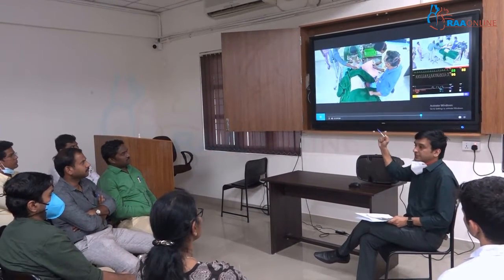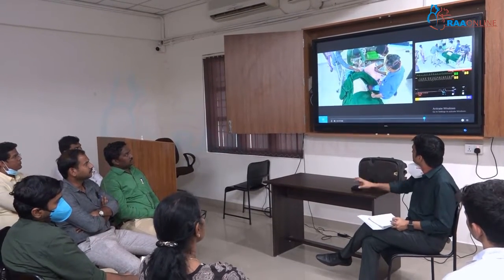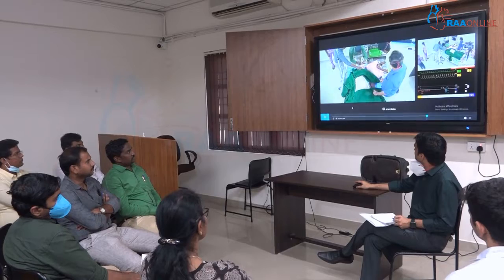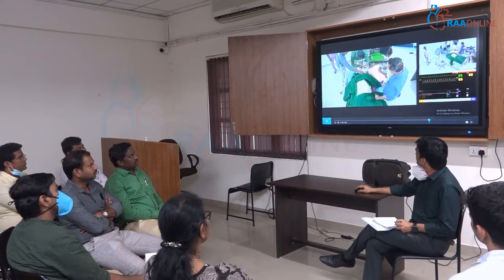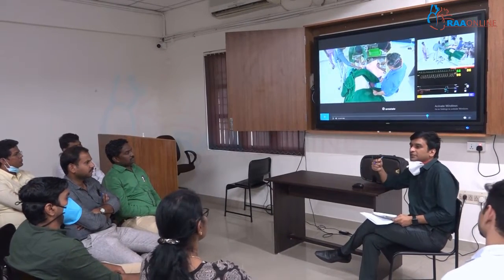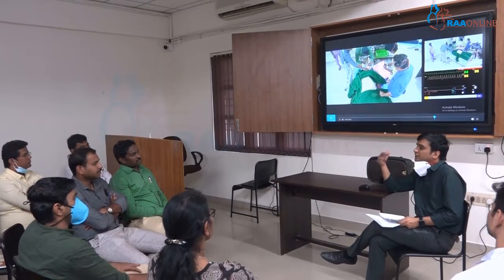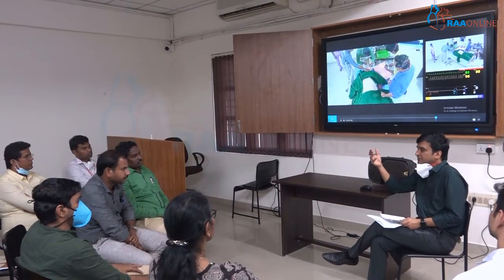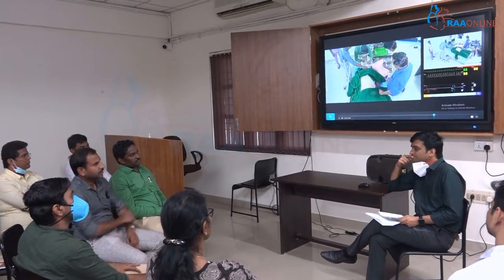So this is the first step. Saturation is fine. So give me just 5 more minutes. I've always wondered how long should I try an intubation before I go back to mask ventilation. What are your thoughts on it? When should I go back to mask ventilation if I'm not able to intubate? When do you do it?